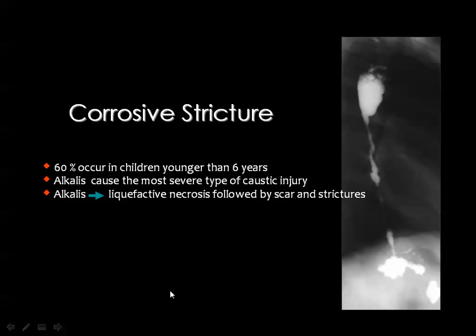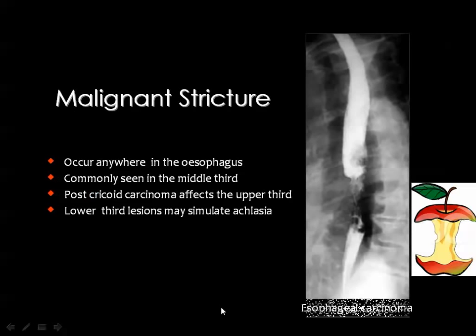And because we are afraid of esophageal perforation, we usually used to give these patients lipiodol instead of barium. This lipiodol is an oily material which is safe if it passes outside the esophageal lumen, just in case there is an esophageal perforation secondary to corrosion. And if we are sure that there is no perforation, we can use barium later on.